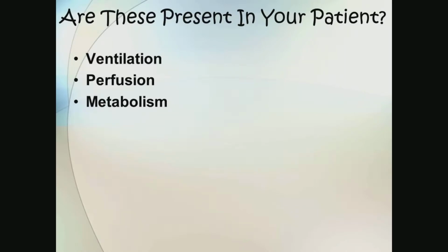If these are present in your patient, you should be monitoring with capnography. The European Society of Critical Care Medicine made a recommendation that any patient who's being mechanically ventilated in the ICU should be monitored with end-tidal CO2. We rarely, if ever, use it. Every single patient who is in the OR undergoing general anesthesia is monitored with end-tidal CO2. Any patient who is receiving conscious sedation should be monitored with end-tidal CO2. And I know that's not done either.